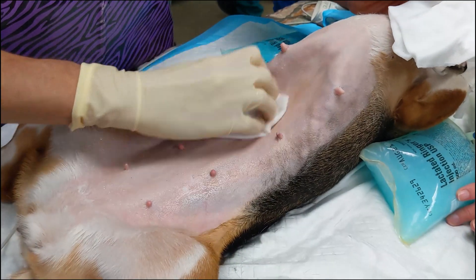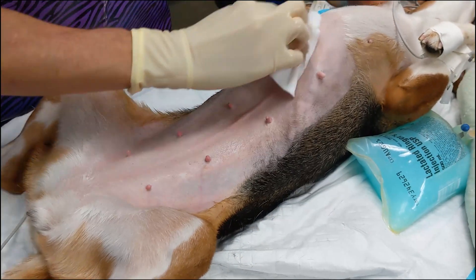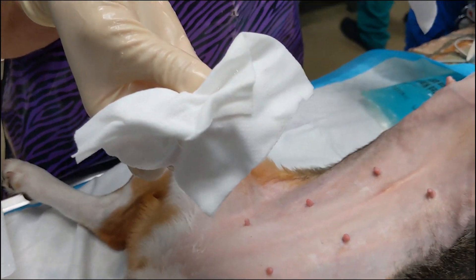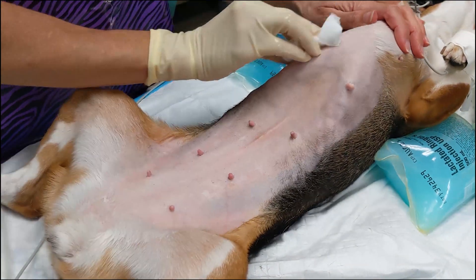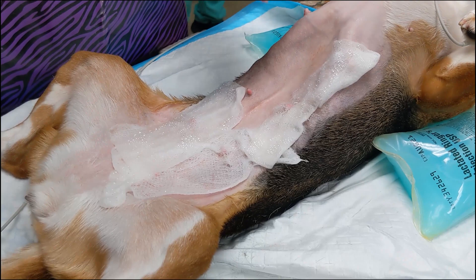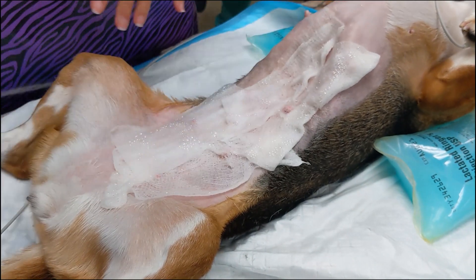The dirty scrub is continued until the gauze wipes away relatively clean. Depending on how dirty the dog is, this typically takes between three to five rounds of alternating scrubs with chlorhexidine and isopropyl alcohol or sterile saline. Before transport to the OR, chlorhexidine-soaked gauze is placed over the surgical site to keep it clean and continue contact time.